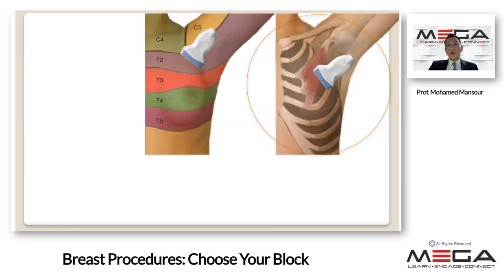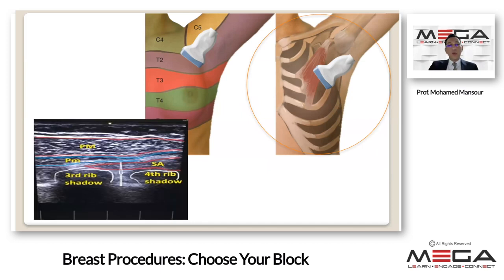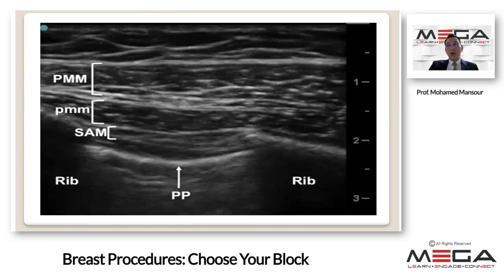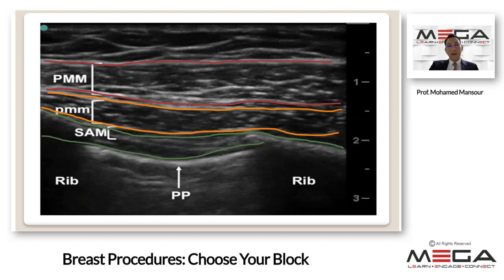To perform PECS-2, a linear high-frequency probe is used, moved laterally to visualize the third and fourth ribs. The serratus anterior muscle is visualized below the pectoralis minor. The pectoralis major, pectoralis minor, serratus anterior muscle, and the parietal pleura can all be identified on the ultrasound image.